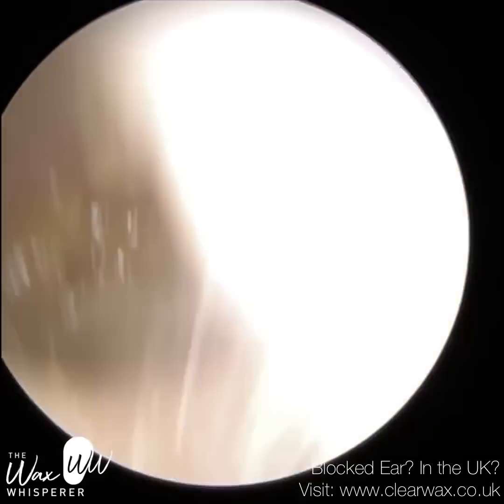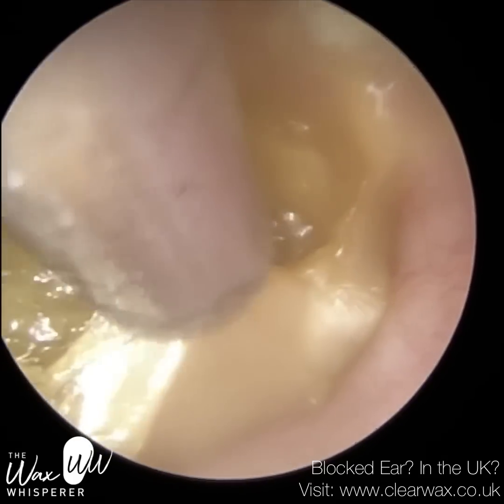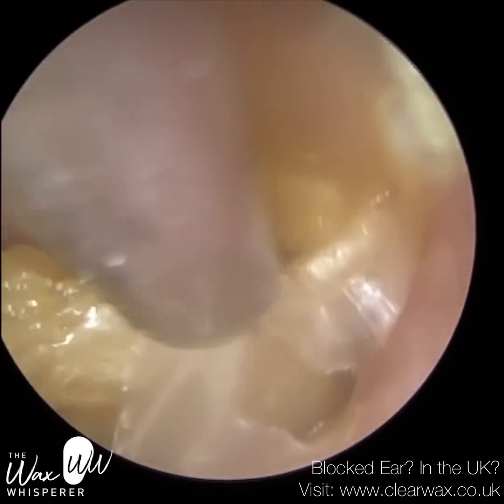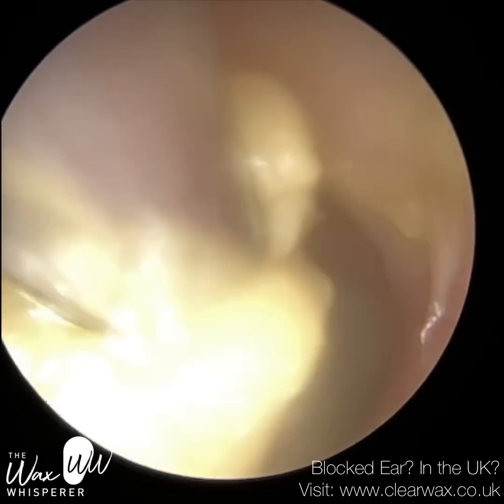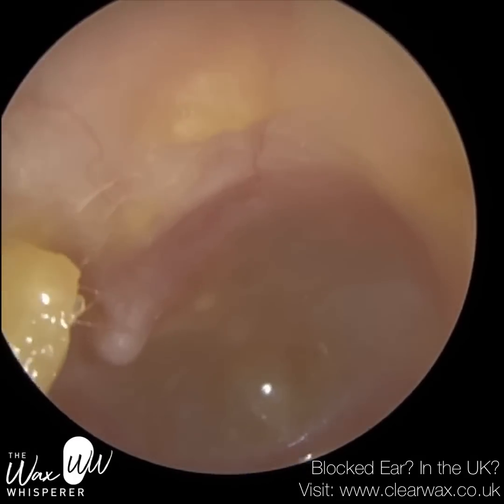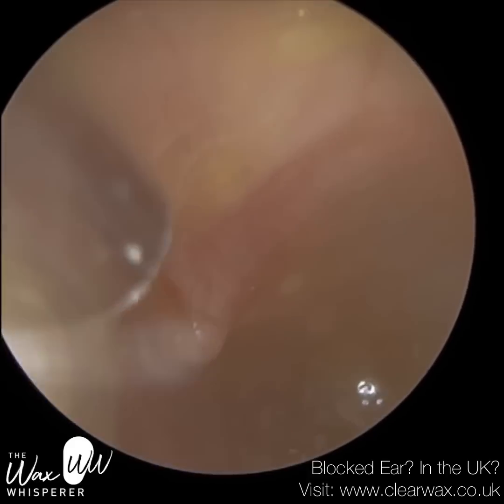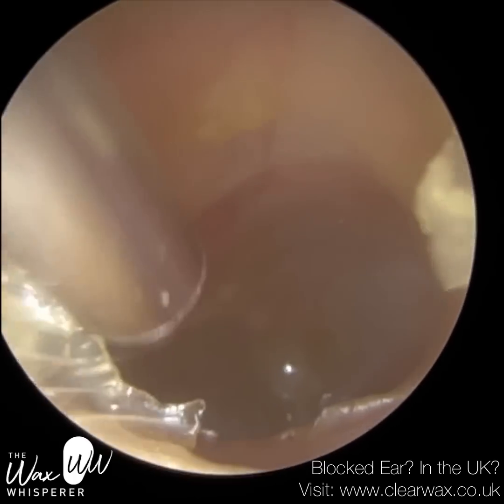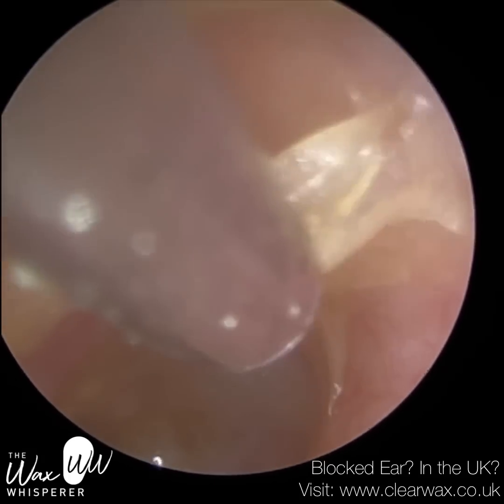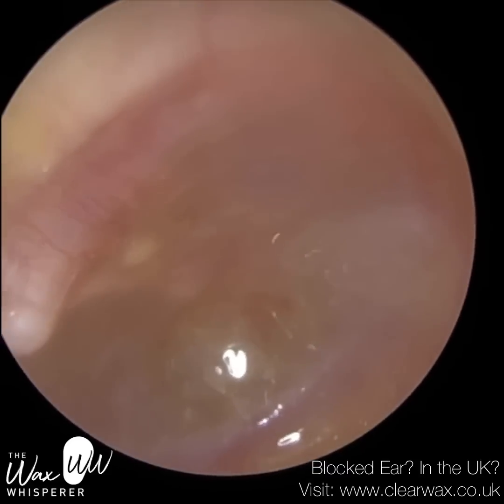You can see all this dead keratin that I'm removing. This is a very glutinous, mushy consistency. The patient's parents have been putting some drops in their ears — sodium bicarbonate drops. The way sodium bicarbonate drops work is, as they enter the ear, the sodium bicarbonate reacts with an acid, which is a byproduct of the healthy bacteria that resides on the skin. They feed off sebum, secreted by the sebaceous glands, and release a carboxylic acid. Sodium bicarbonate reacts with that and changes into water and carbon dioxide — from a liquid to a gas — which creates mechanical foaming and effervescence, which then breaks up the skin, hence why you get a mushy consistency.